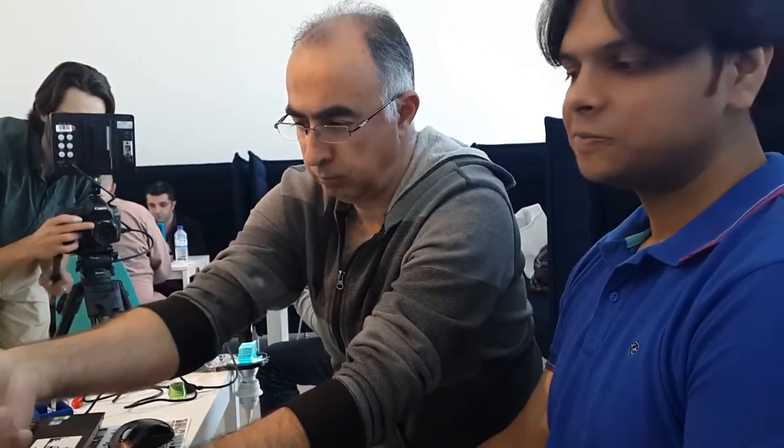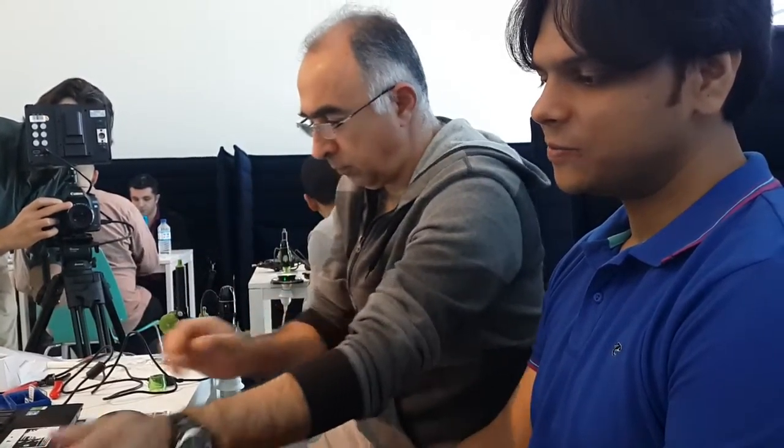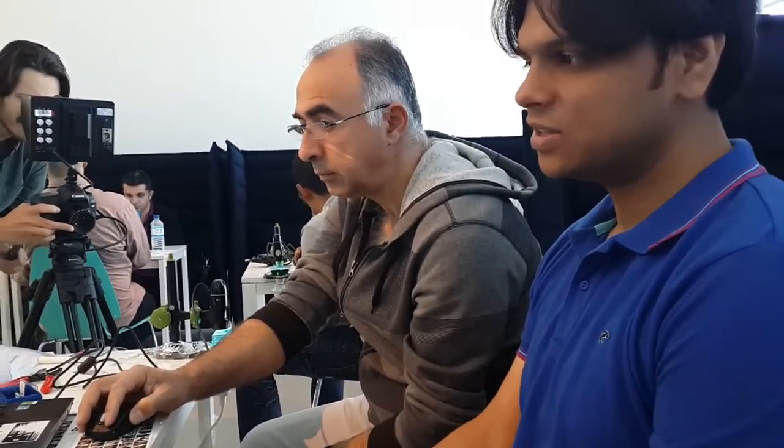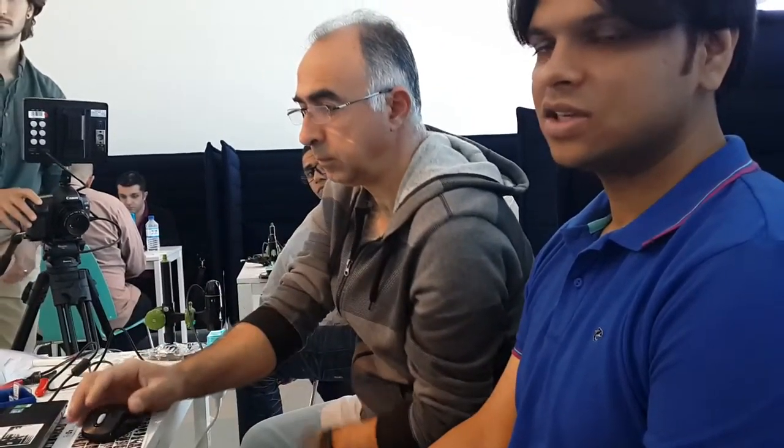We are building this microscope toolkit that's very portable and can be put in your laptop bag. You can take it to the field, take it anywhere you like and do blood tests. You can count blood cells, detect iron deficiency from blood samples, do anemia screening, and even detect cancer cells. So that's it.